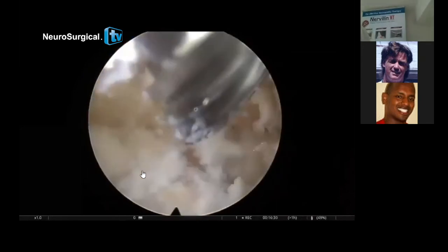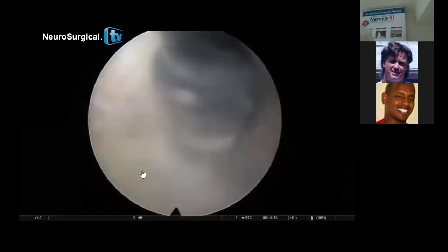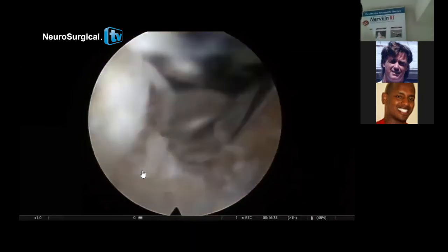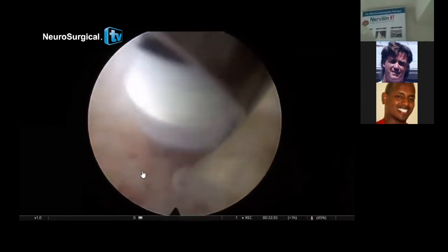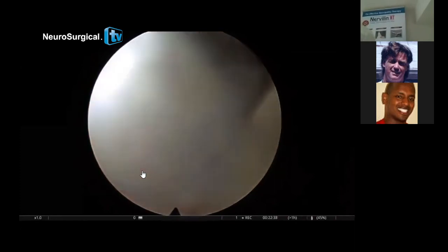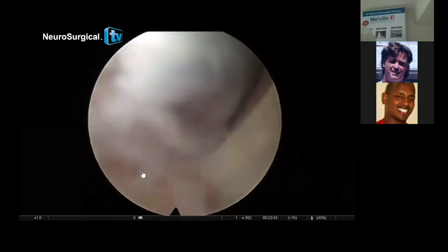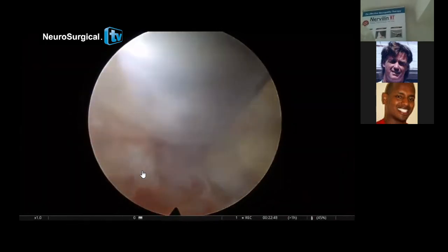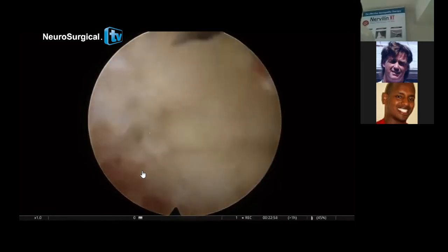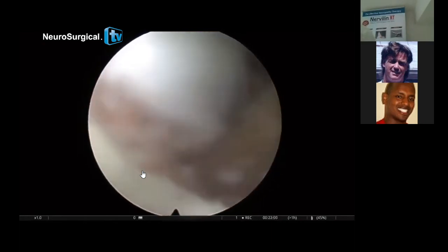First, you take the ligamentum flavum superficial, and you have to cut some bone, the shoulder of the lamina, just to widen your window. You see, some guys take the flavum before this procedure, but I believe it is safer to keep this deep ligamentum flavum and then do the bone resection, because it protects the neural structure, and then cut the ligamentum flavum.